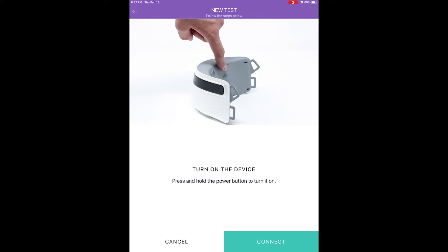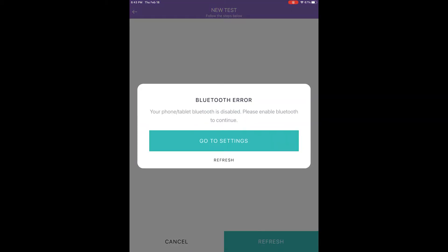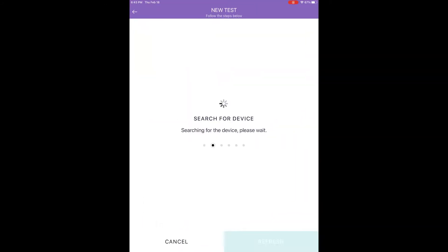Step four: Connect Device. Press Connect and wait for the device to establish Bluetooth connection automatically. If multiple Breezing devices are present in the same room or neighboring areas, please select and verify the correct device ID. If the Breezing device does not connect, make sure your mobile device has Bluetooth on, reset the Breezing device by turning it off and then on, make sure the blue LED light is back on, and then press Refresh again.